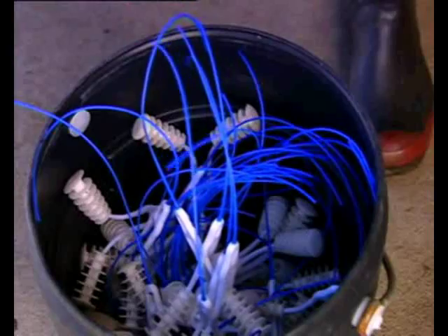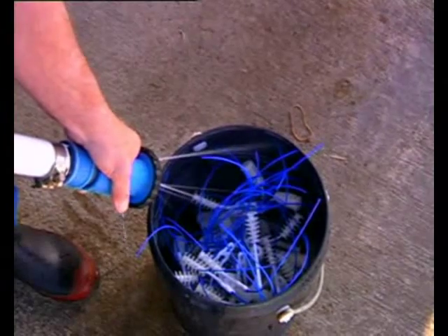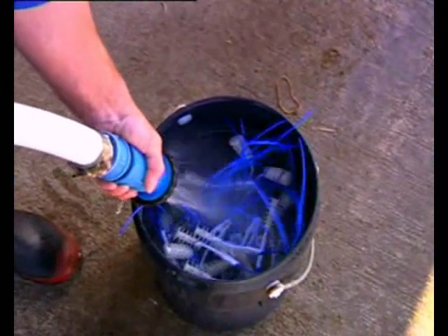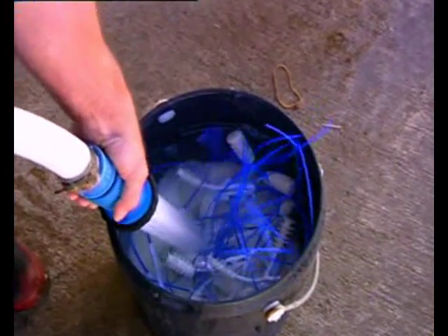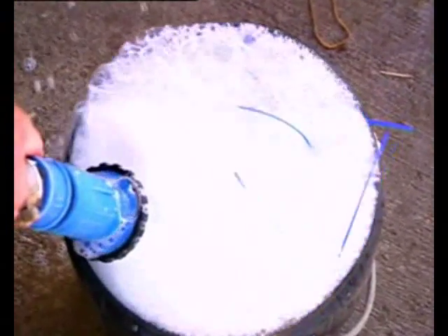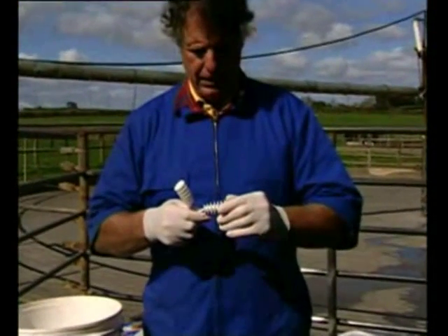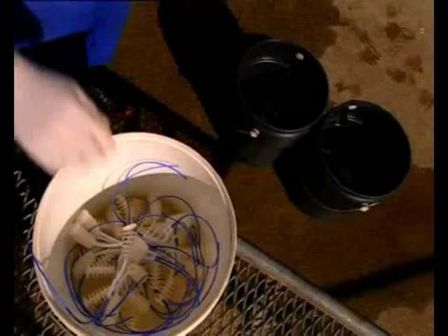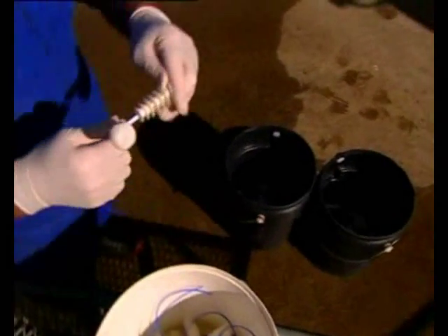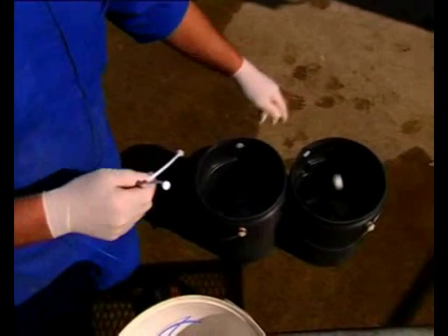With Q-mate, there is an option to reuse wishbones. After removal, shake off excess mucus and place the used Q-mate into a bucket. This removes residual mucus from the pods, making them clean to handle. Place the cleaned Q-mates on a suitable surface and remove the pods and tails from the wishbones as shown.